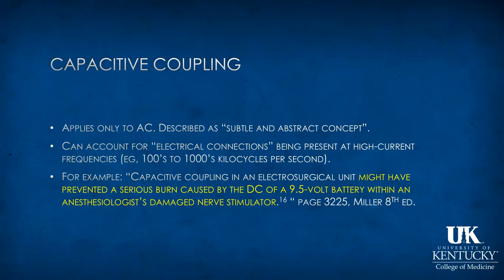Now, capacitive coupling is described as a subtle and abstract concept, and it can, outside of the electrosurgical unit itself, account for electrical connections with the patient apparently being present at high current frequencies, in the hundreds to thousands of kilocycles per second.